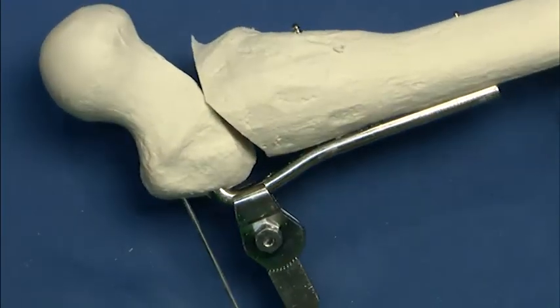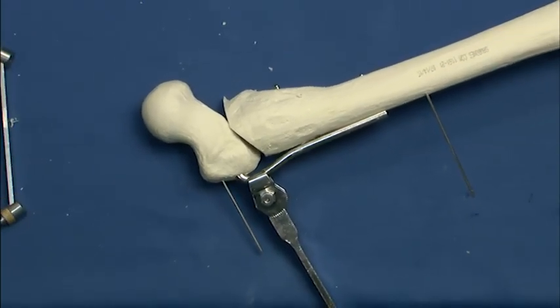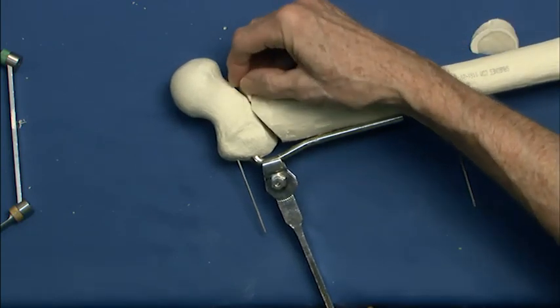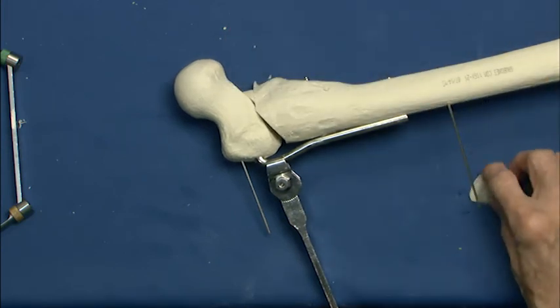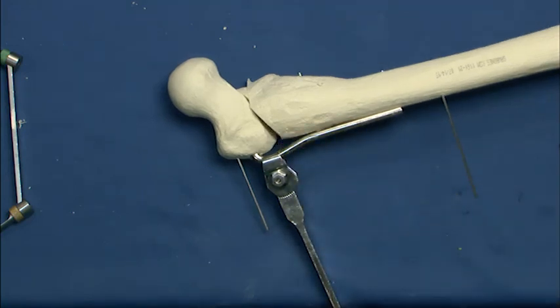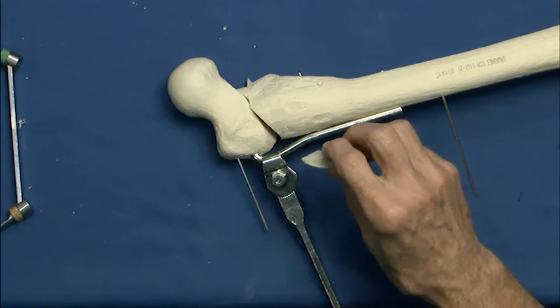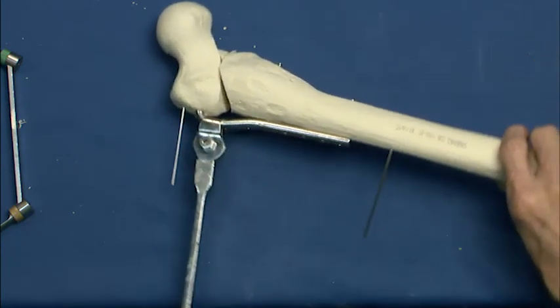Now, you saw that we had two pieces of bone generated by the closing wedge, and it is possible, if you're going to generate a large opening wedge over here, to insert this at the beginning of the case and leave it like that. Or if you have bone left over at the end, particularly if you've done much of a shaft translation, then you can actually fill in underneath the blade with the remainder of this closing wedge and cut it to size. So at this point, we have now a frontal plane correction.